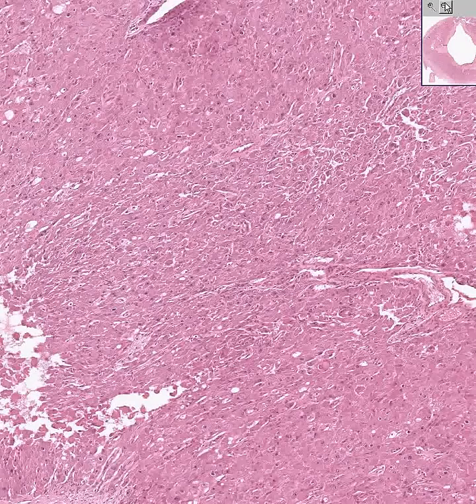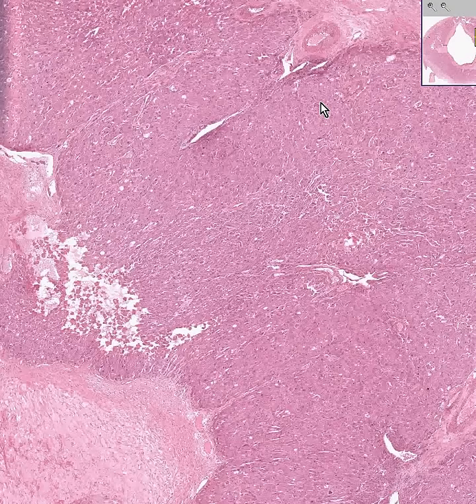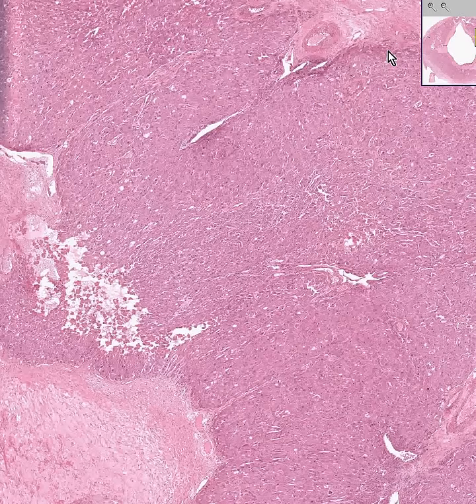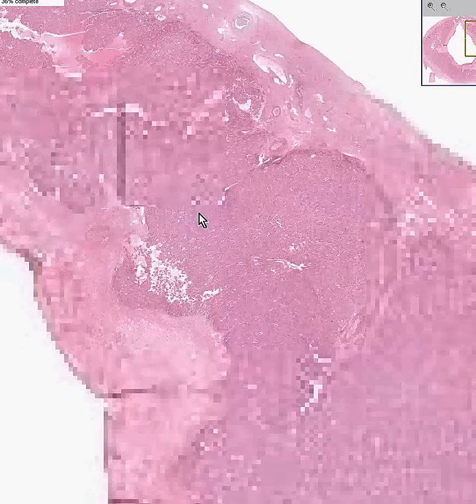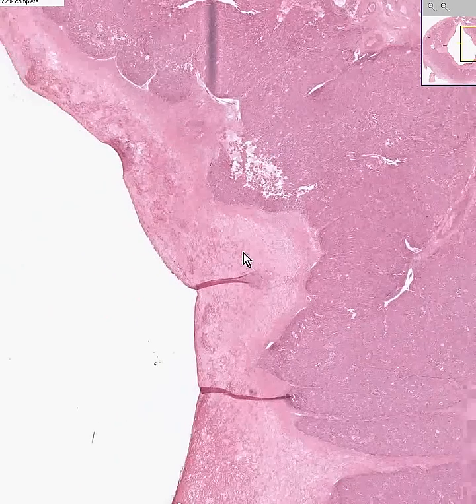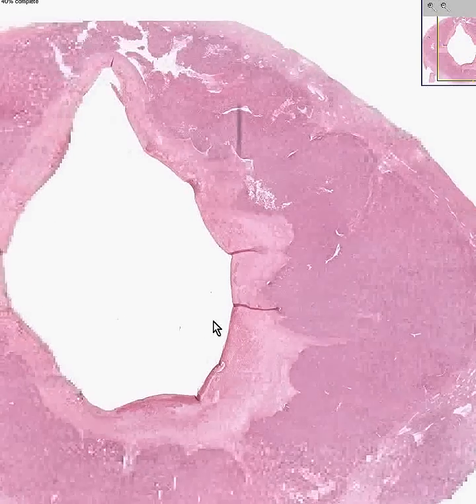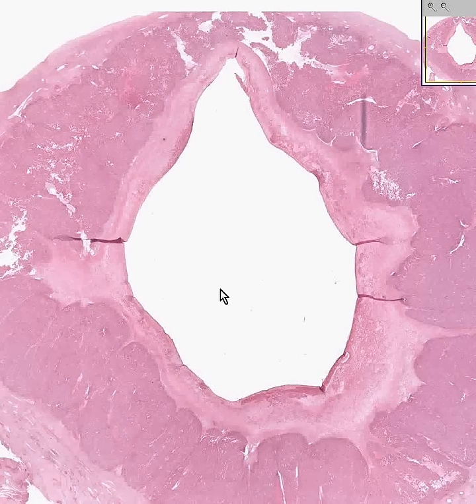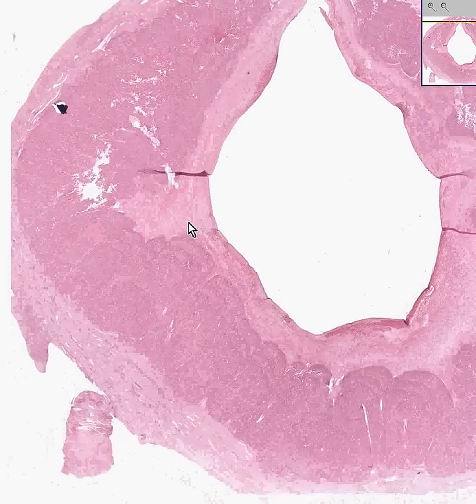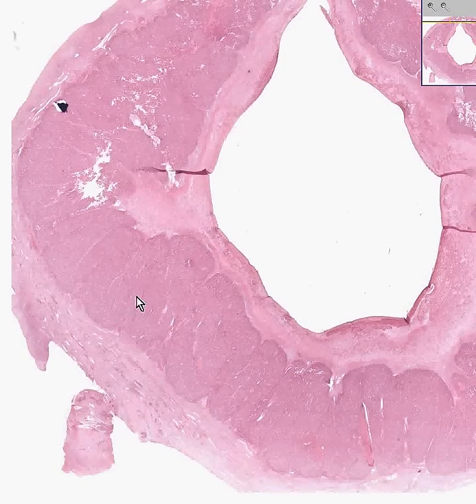The corpus luteum, if there is a pregnancy, can be a very significant fraction of the volume of the ovary itself — perhaps a third or a half. Otherwise, they generally are just a small fraction of the ovary's volume. As you can see here, they can have a lot of hemorrhage because they are very vascular. In this particular corpus luteum, it looks like there is a central liquefaction, which is why there's no luteal tissue in the center. But the endocrinologically active cells are these foamy cells all along here.